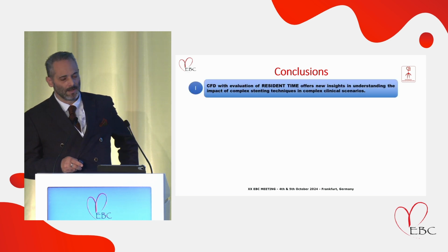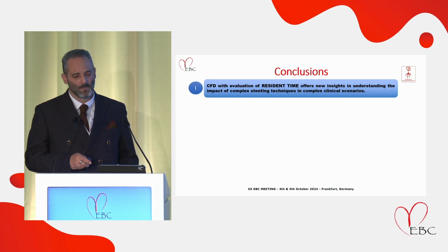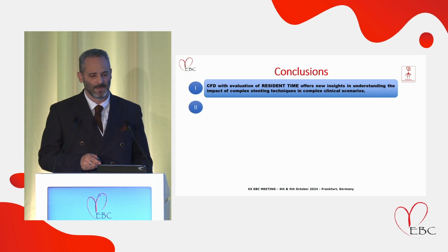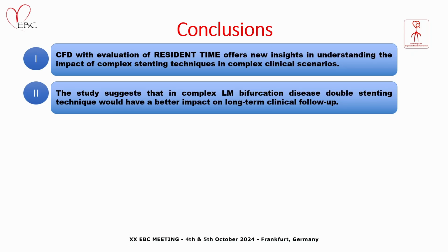First, evaluation of residence time by computational fluid dynamics offers new insight and understanding of the impact of complex stenting techniques in complex clinical scenarios. The study suggests that in complex left main bifurcation disease, double stenting technique will have a better impact on long-term clinical follow-up, and this is also shown by the clinical data, actually.